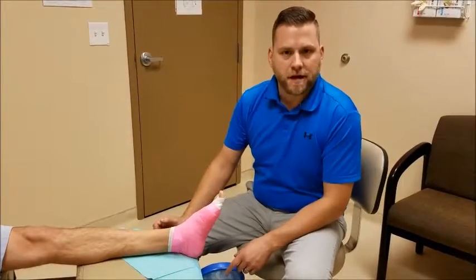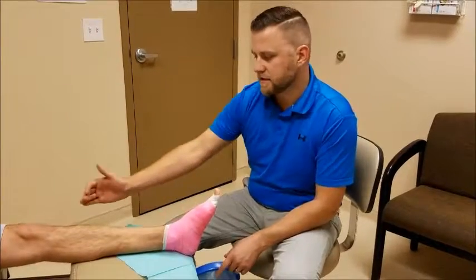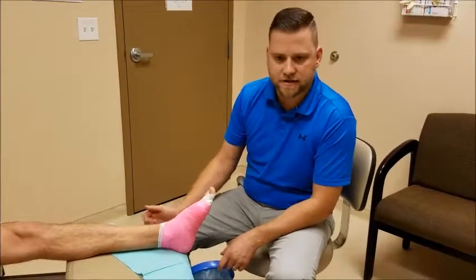Here at Foot & Ankle Associates, our patients often have to wear a dressing because of a wound or a surgery, and in some cases even a cast if they had a fracture or a bigger procedure done. When you have that done, it obviously makes bathing difficult, so we want to make sure that that dressing or cast stays dry.